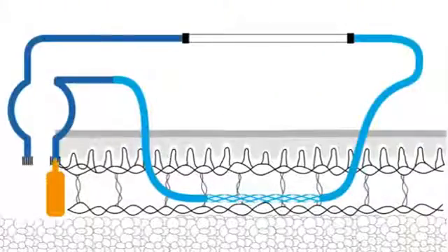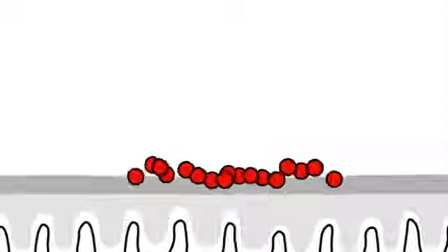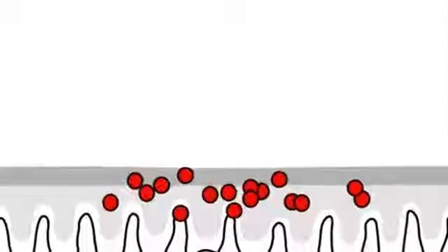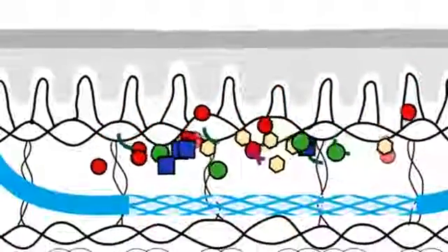In this schematic illustration, the OFM catheter is placed in the dermal layer of the skin. A topical drug is applied to the skin, penetrates its corneal layer and diffuses into the epidermis and dermis to exert its therapeutic effect. At the same time, the drug, biomarkers and interstitial fluid are collected in the OFM catheter.